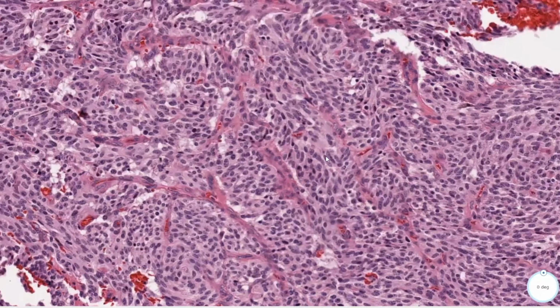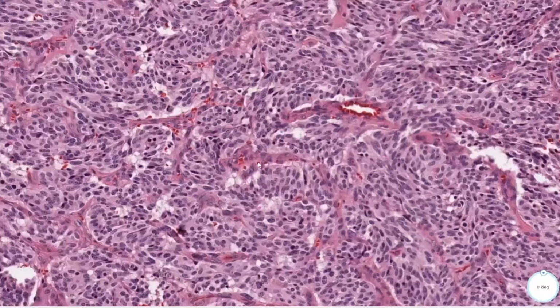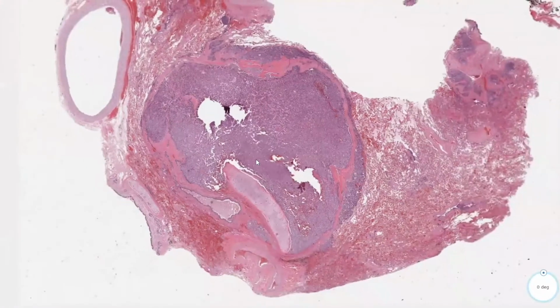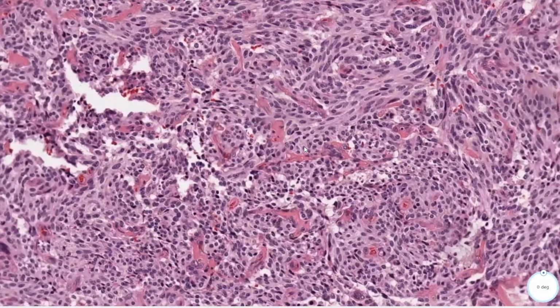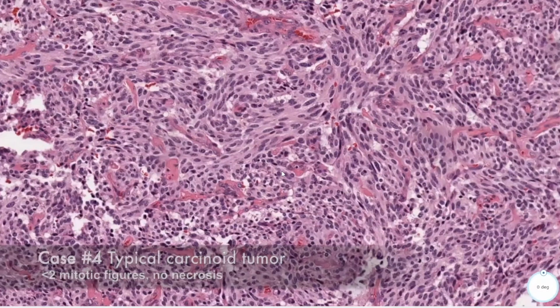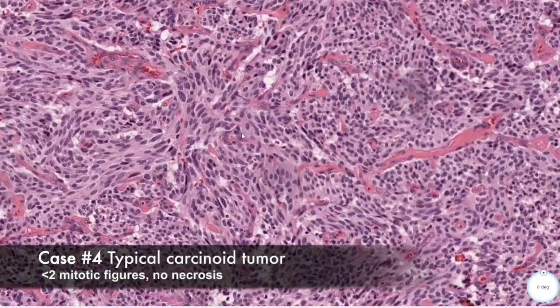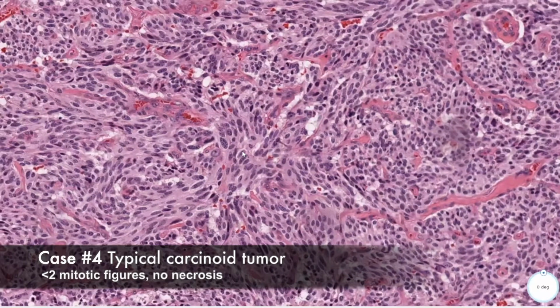So this morphology and that chromatin is really consistent with a neuroendocrine tumor. And so in the lung, we classify these as carcinoid tumors. And then we further subclassify them into typical and atypical carcinoid. The distinguishing feature is the presence of mitoses as well as necrosis. So you have to go through and count the number of mitotic figures, and you're counting per 2 millimeters squared. Tumors that have less than 2 mitotic figures per 2 millimeters squared are classified as typical carcinoids.